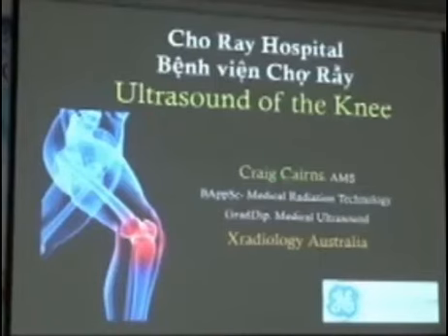So this afternoon session, we're just going to talk about ultrasound of the knee and what we can expect to see in that area.